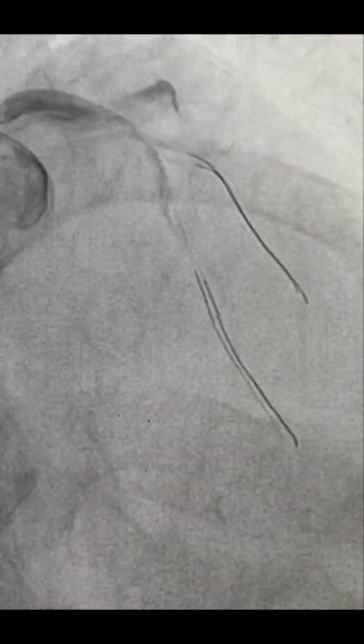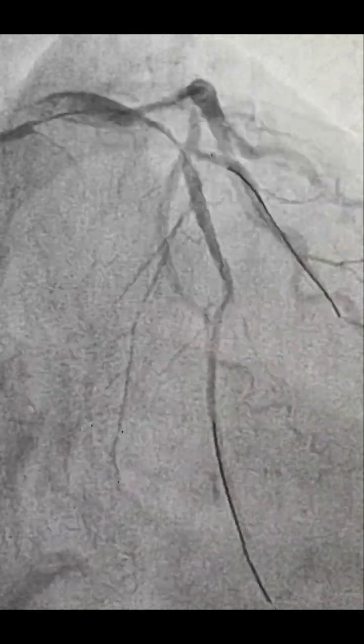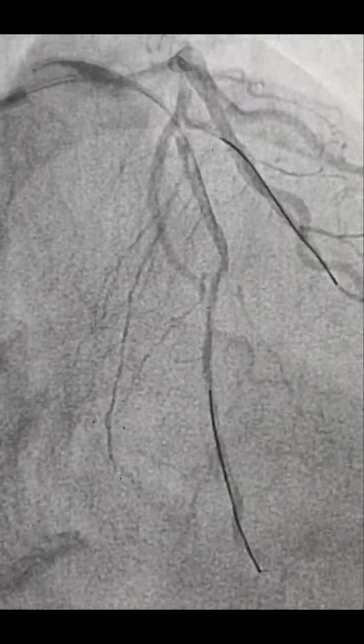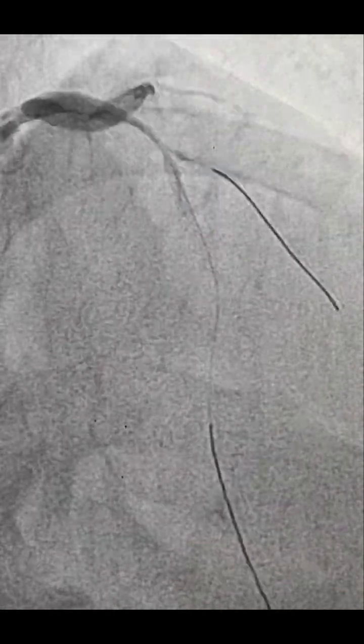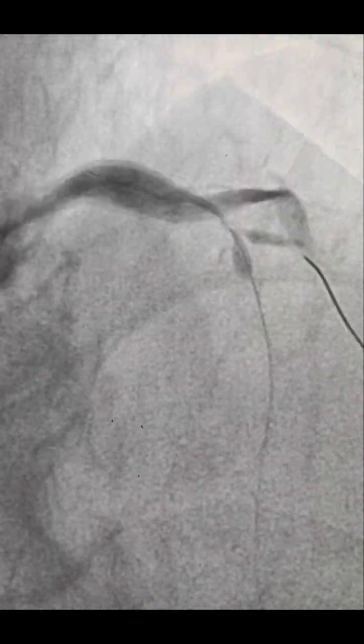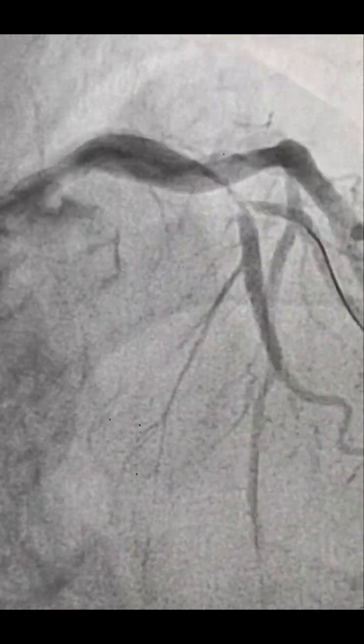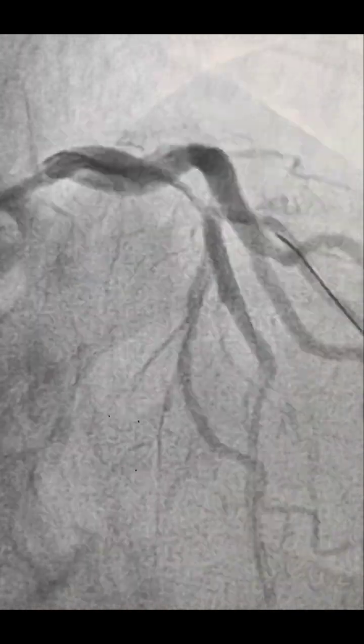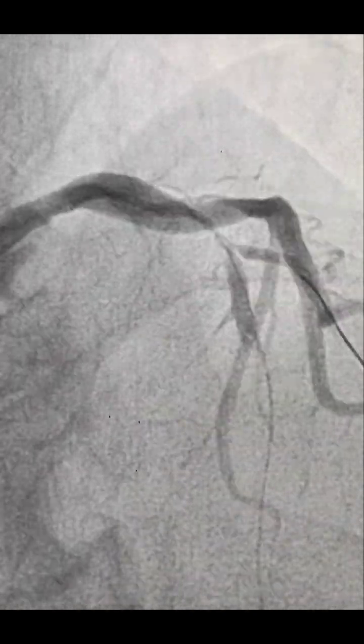So the wire went into this small LAD, and somehow I managed to put the wire through that bend into the large LAD. So now in this view, we already anticipated this slow flow, no flow. You can already see there's a slow flow now after putting in 2 wires.